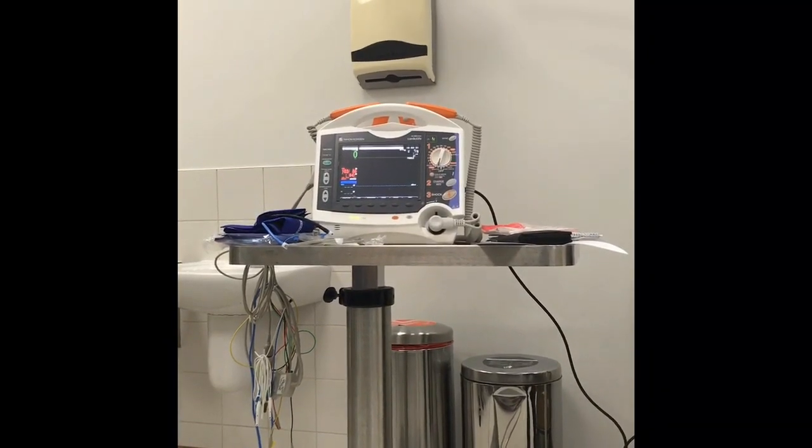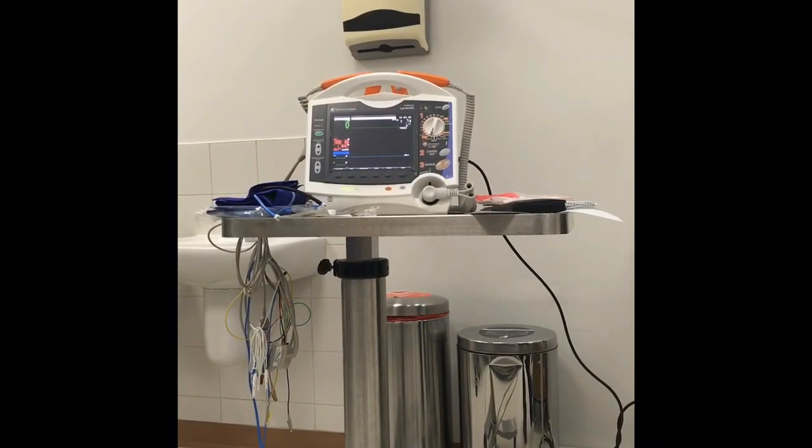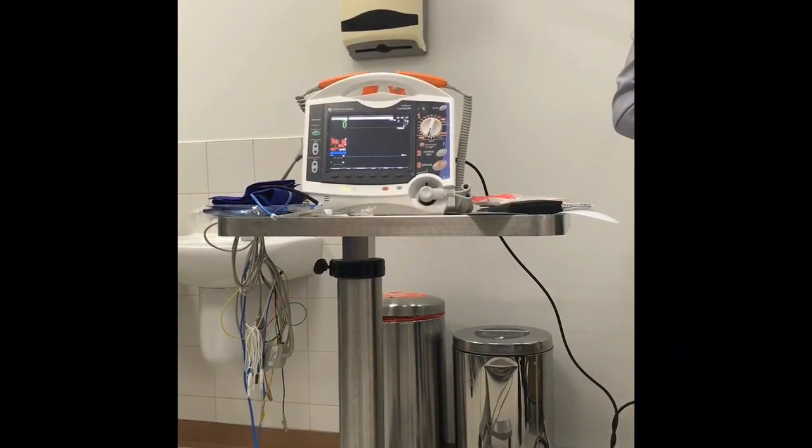We are going to supply the disposable SPO2 probes. The monitor is just to connect and have monitoring. Okay?